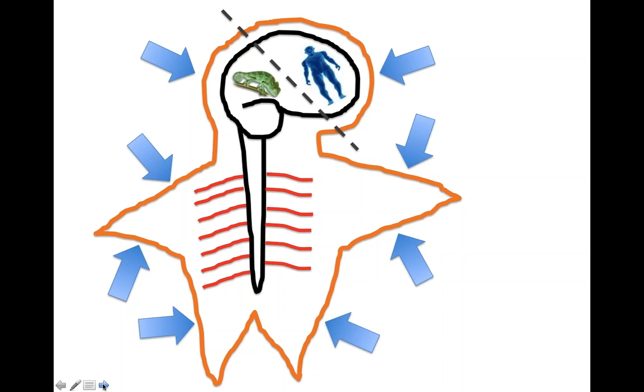There are areas, and I'm going to show you some interesting research, of patients that may have chronic pain, that have lack of sensitization in certain areas, specifically OA of the knee and chronic low back pain patients. So mitigating pain through some lighter strokes, as light as feathering, believe it or not.